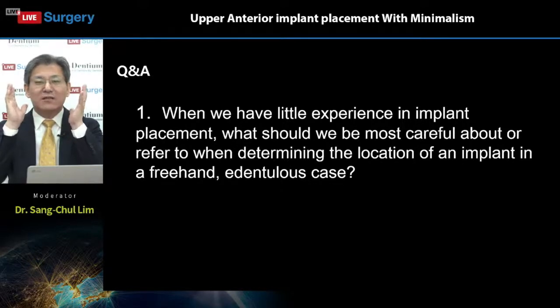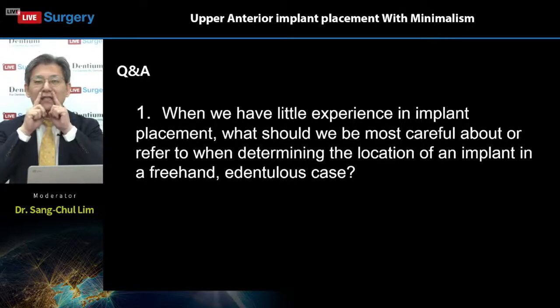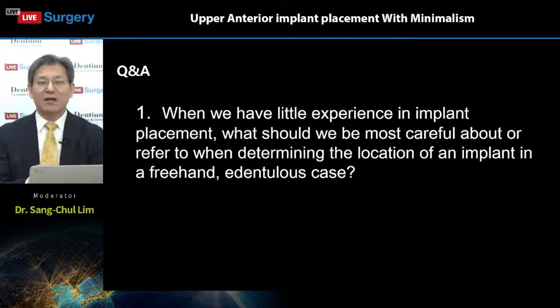So we consider all of these reference points in converting them to a proper position for implant installation, right? After establishing the canine position using this alar reference line and the midline, the other positions, like the premolar and molar, are easier to find. Sometimes we can use another reference point, the mental foramen on the radiographic panoramic view, but it is not the main point. This one is just an auxiliary reference point. The main points are the midline and ala, and the arch position is also important.